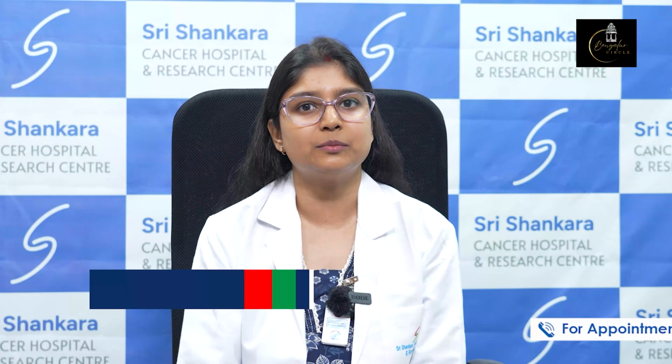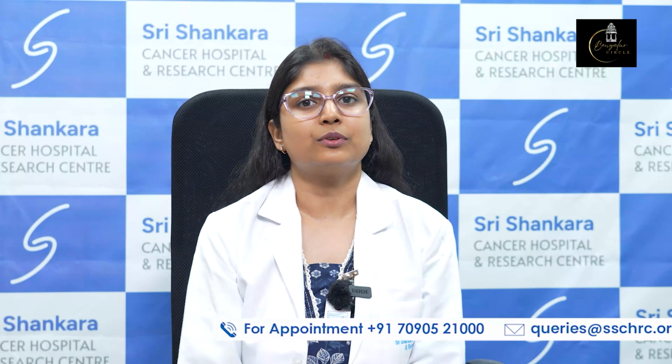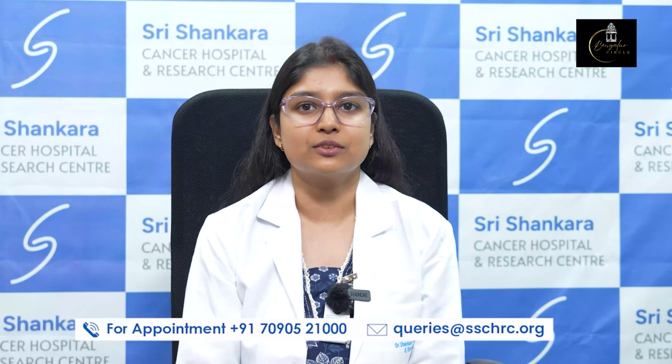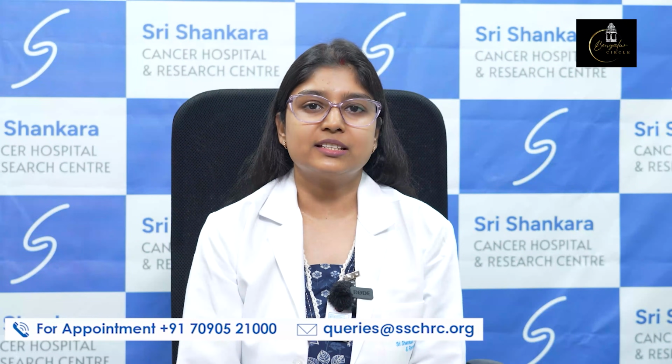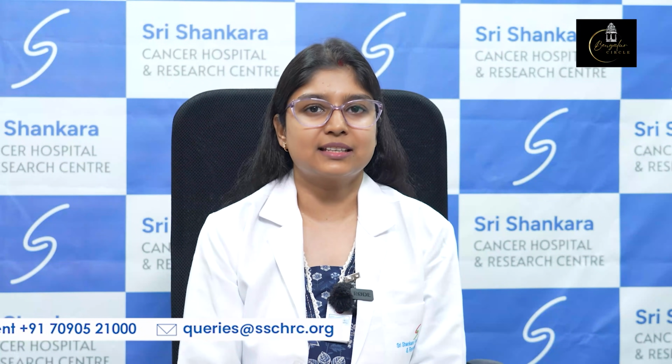Once the patient has been started on certain treatment, the patient has to undergo PET-CT as a response assessment scan. Whether the treatment is actually working for the patient or not can also be assessed by PET-CT scans. So at staging, at treatment response, and also if the patient is suspected of recurrence. If the patient has been treated earlier and there is a chance of recurrence, if there is any clinical symptom suggestive of recurrence, a PET-CT scan can be done to look out for any recurrent sites.